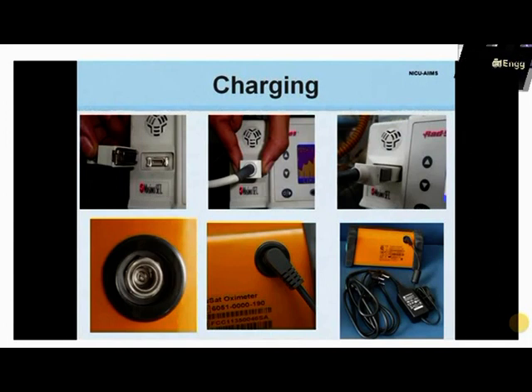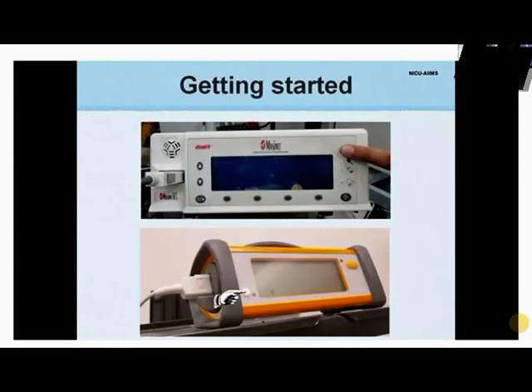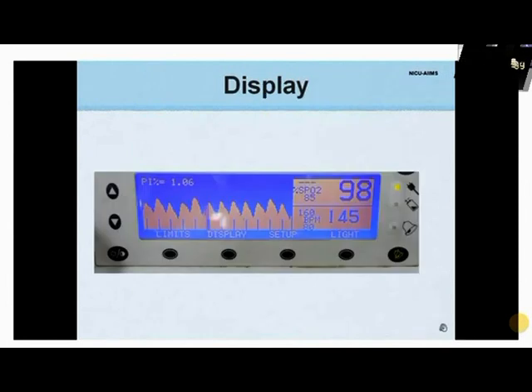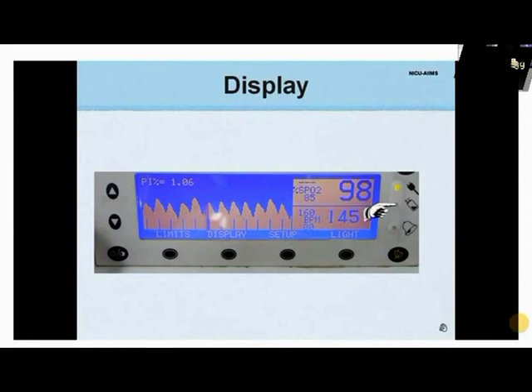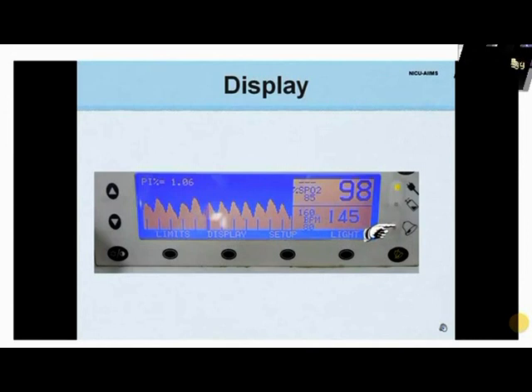Some pulse oximeters have a slot for connecting the charger, while others have a direct slot for AC power connection. After switching on via the ON button at the front panel, this light indicates the connection of the charger, and this light blinks when the battery is running on low charge. This is the alarm signal which blinks if values displayed skew beyond the set limits.